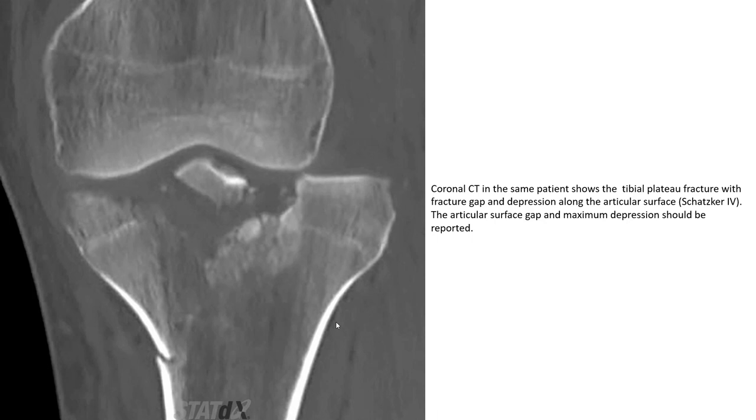The CT shows a tibial plateau fracture with fracture gap and depression along the articular surface. The articular surface gap and maximum depression should be reported.